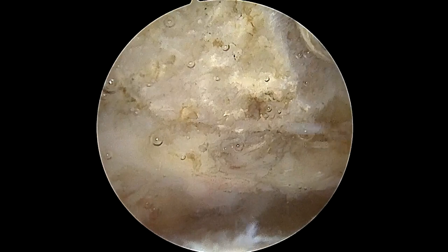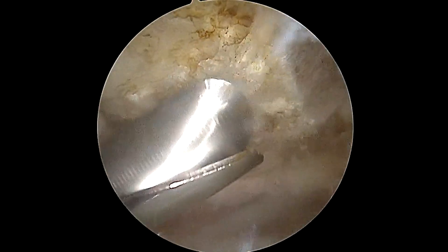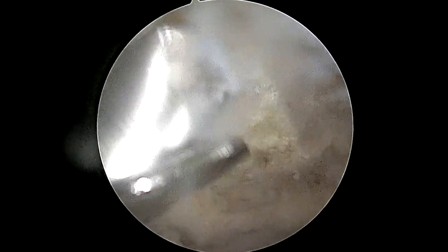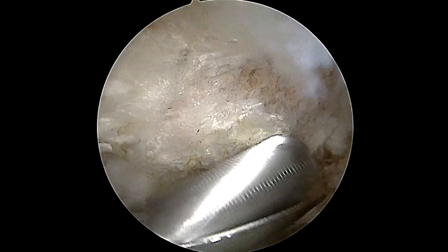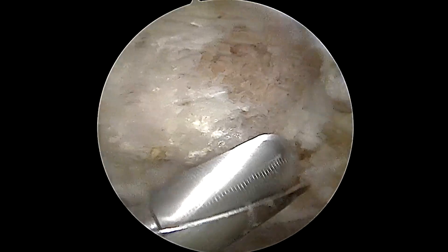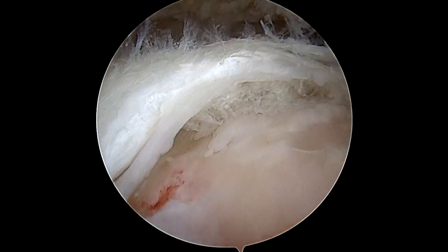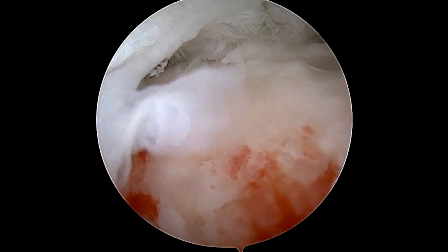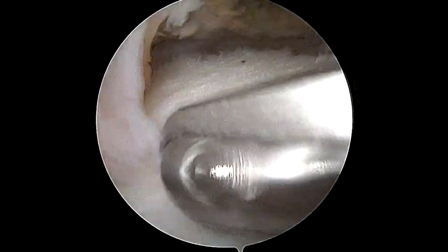We're looking from the side view now — the front of the shoulder is towards the right of the screen. The burr instrument is introduced from the back side of the shoulder, and we continue to smooth out the undersurface of the acromion. We don't want any sharp, pointy bone edges poking down into the rotator cuff after we do our repair. Additionally, this allows marrow elements to come into the repair area, which can promote healing. The rotator cuff is the white layer in the middle of the screen. Underneath it, the pinkish layer is bone — we're not supposed to see the bone here because the rotator cuff is torn in a full thickness manner and retracted, allowing us to see the underlying bone and even into the shoulder joint, which is supposed to be sealed by the rotator cuff.